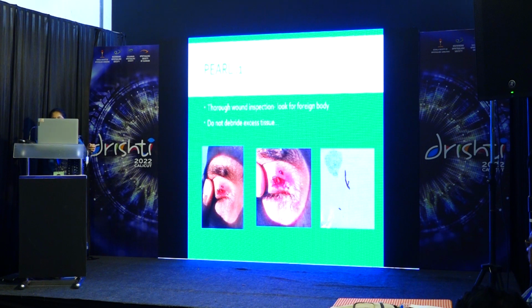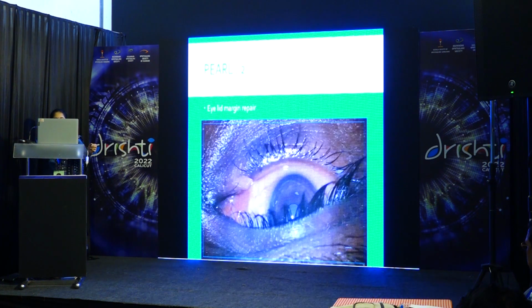So that should also be kept in mind. And so this is the small foreign body which is in the wound. Okay, so moving on to the lid tear marginal repair, which is very important because proper apposition is going to prevent the lid marginal notching.